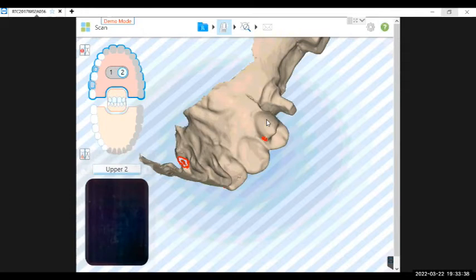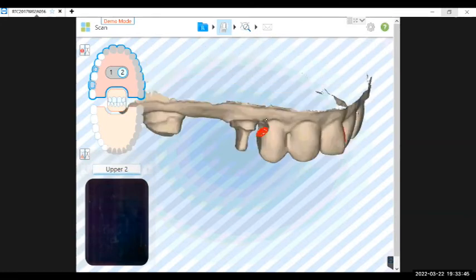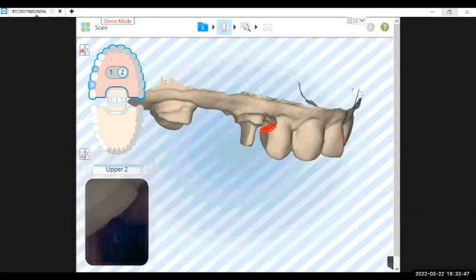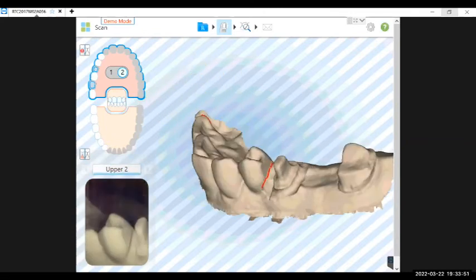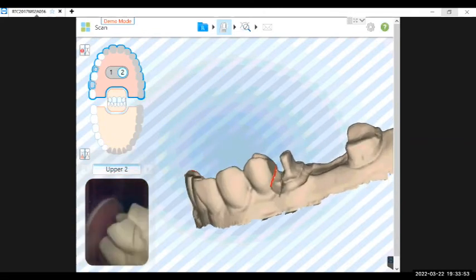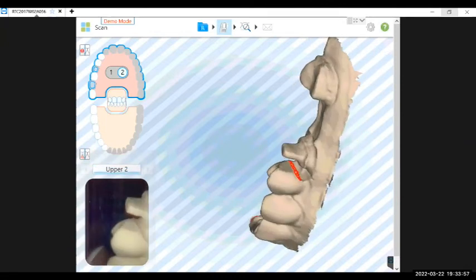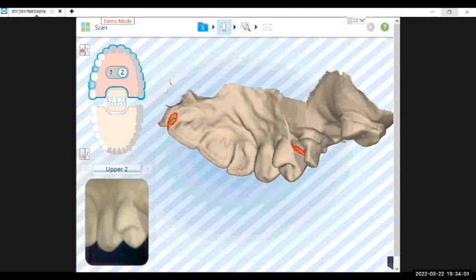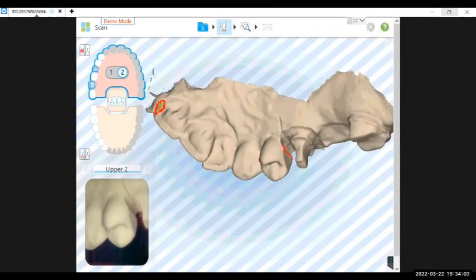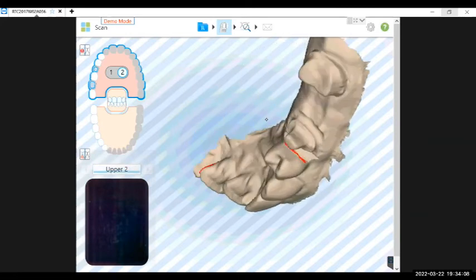And there is a timer associated to this. So once you hit the fill tool and it encircles in red, you really want to begin scanning right away. If you don't, the encircled area, the red circle, could potentially disappear and you don't really realize it. And then if you start scanning, you're adding layers, not truly using the fill tool. So just be conscious of that.